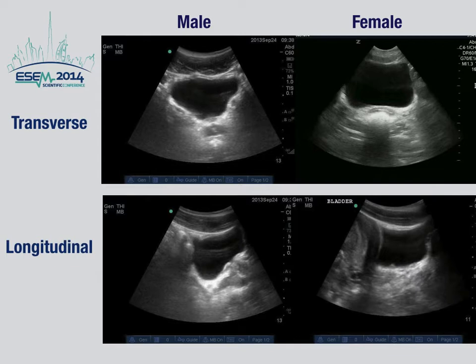Examine the fluid posterior to the bladder or posterior to the uterus and in between the loops of bowel. It is important to look in both the transverse and longitudinal plane for fluid behind the bladder, as the sagittal, also known as the longitudinal view, is more sensitive for a small amount of fluid when compared to the transverse view, because free fluid outside the posterior bladder wall is easier to identify in the longitudinal plane. Moreover, occasionally if the bladder is very full, the transverse view is obtained higher in the peritoneal cavity, so the most dependent part of the pelvis, which is the rectovesicular space, is missed.